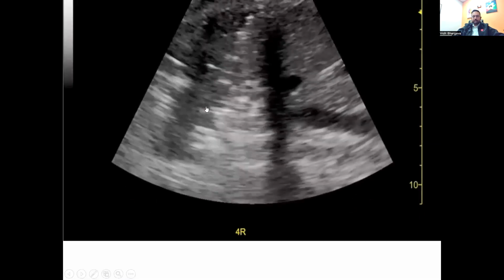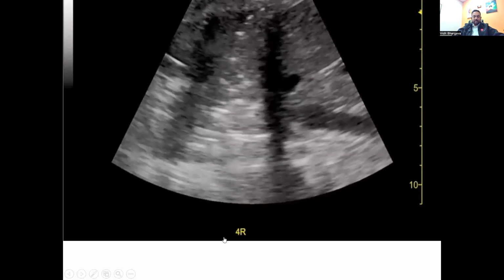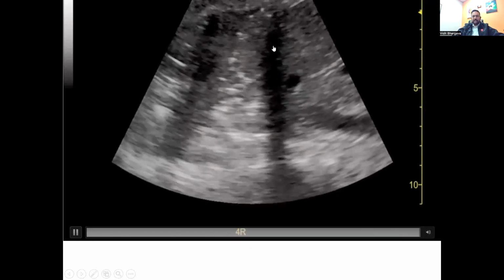And so if I remember correctly, this is the patient's right side. And we know from our general understanding of ultrasound physics that for the most part, if there is an area that is full of air without any fluid or consolidation, generally we tend to see just these reverberation artifacts and not much more. So all you see are some A lines on this side, which look pretty good. Or I guess that was the left side. Sorry, this is the right side here.